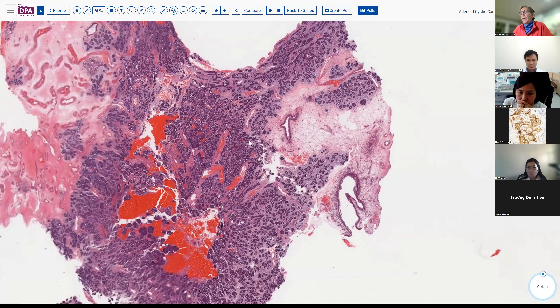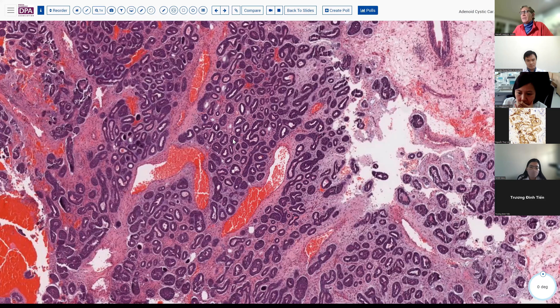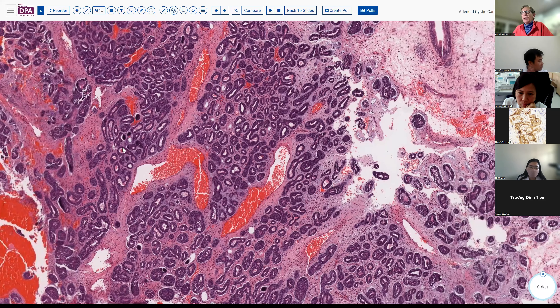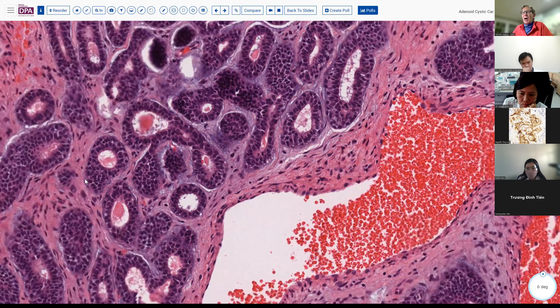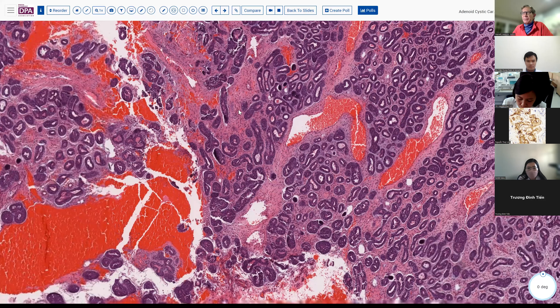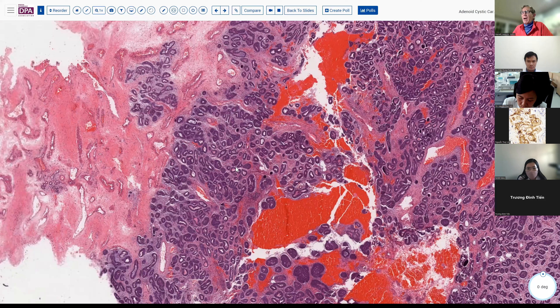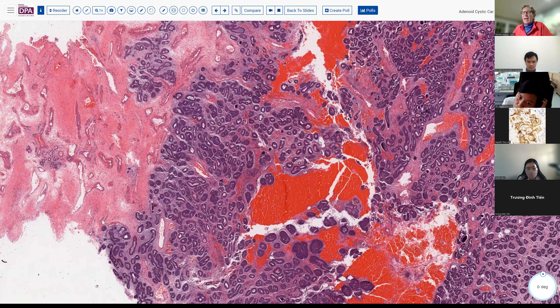Here's a nice example. We see some larger ducts and then this sort of organoid pattern with small cystic spaces and some solid areas. As you look at the nuclei, they tend to be fairly small and compact. You can maybe see two cell types in here to some degree, not always. This would be sort of a tubular or organoid pattern. A little bit of solid differentiation. In this particular case, I didn't see perineural invasion right off the bat, but you can see it's not encapsulated — it has a somewhat infiltrative nested pattern of growth out into the surrounding tissues.